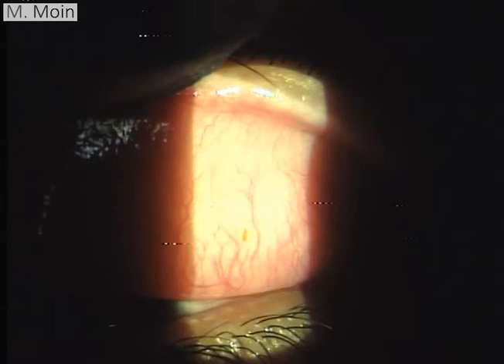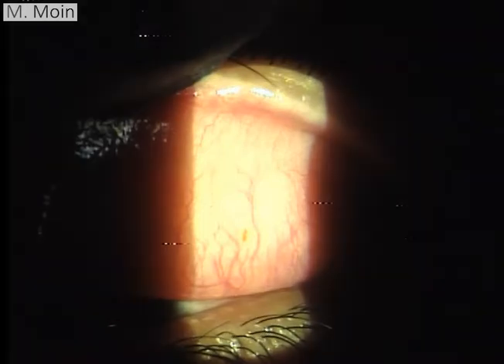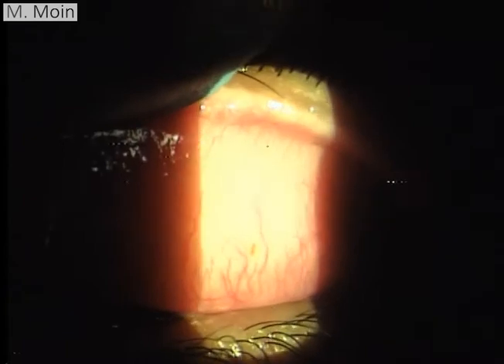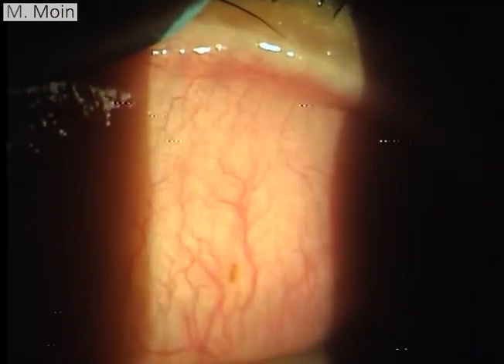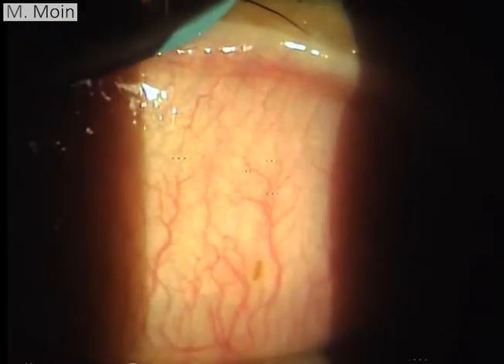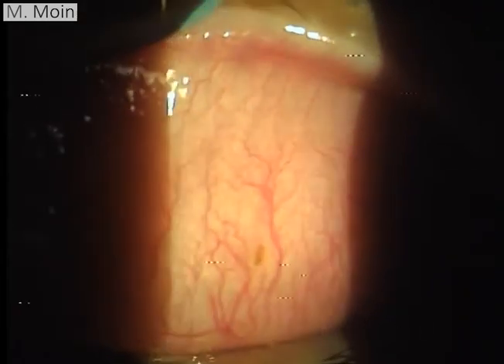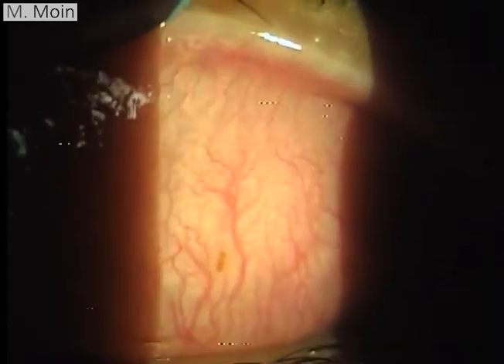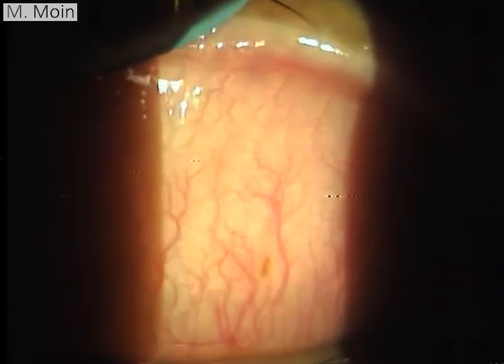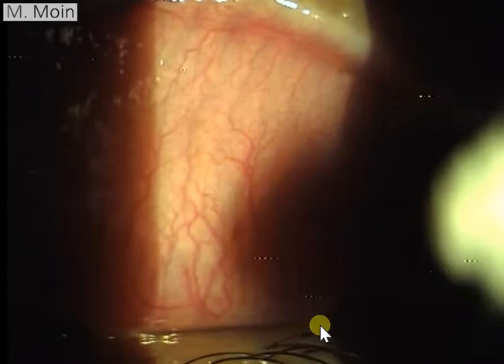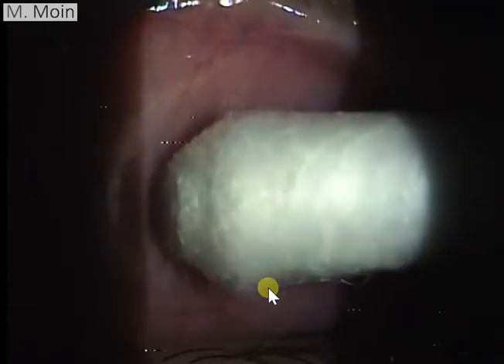Let's go to a higher magnification to look at that foreign body under better visualization. Here you can see that foreign body easily. This could be a piece of a leaf which has gone into the eye and is causing that congestion.